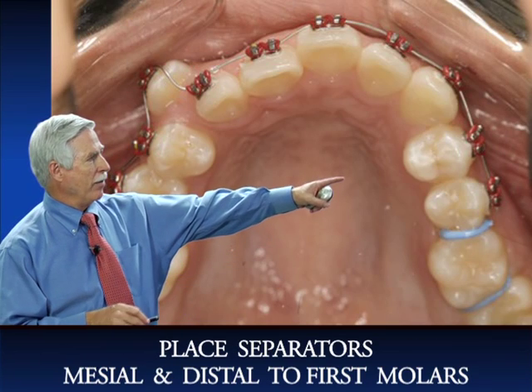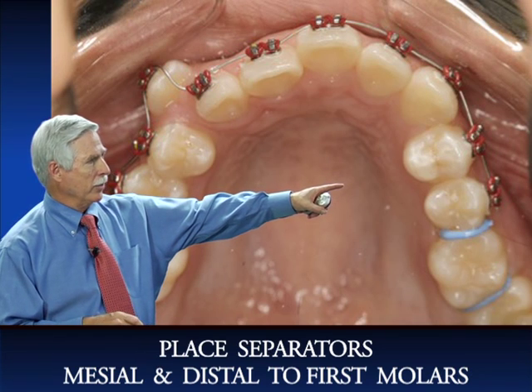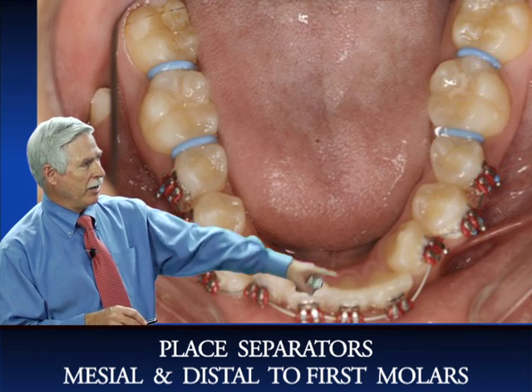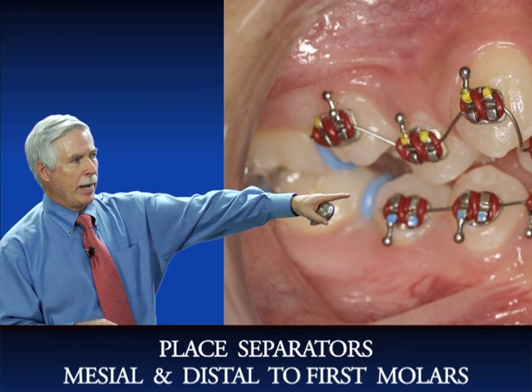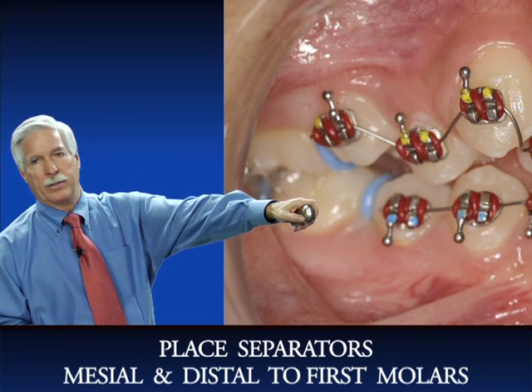Here you can see now we've placed all the wires here. And you've placed the separators, mesial and distal to the molars. And the lower, again, you've placed the brackets from second bicuspid to second bicuspid, and you've placed the separators, mesial and distal to the molars. And you're going to bring the patient back. You can see the separators over here. You can bring the patient back, and you're going to place the molar bands in a week.